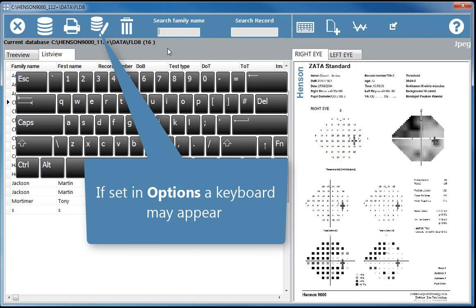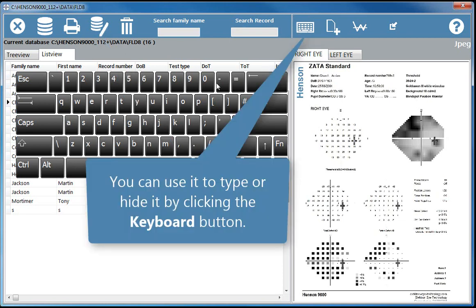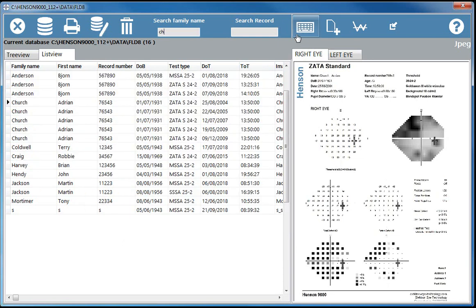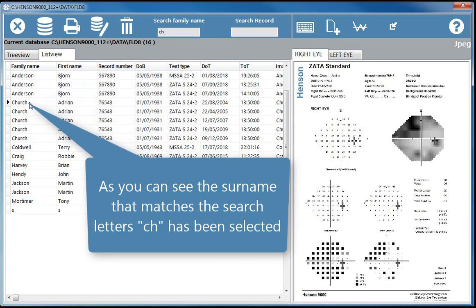If set in options, a keyboard may appear. You can use it to type or hide it by clicking the keyboard button. As you can see, the surname that matches the search letters CH has been selected.